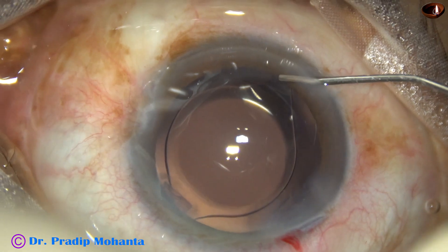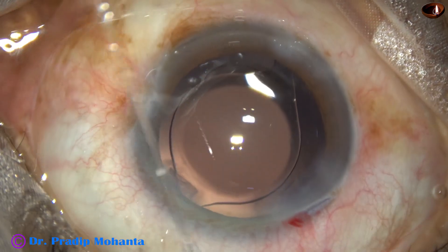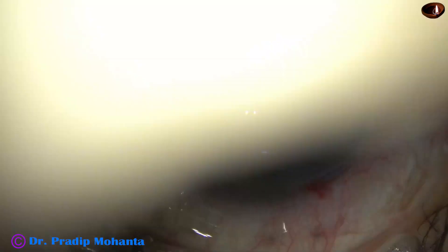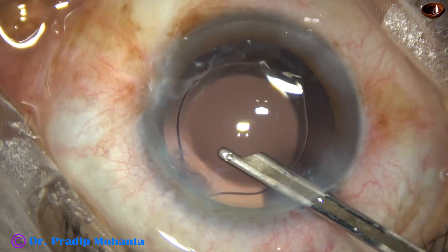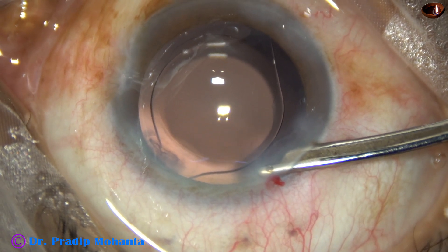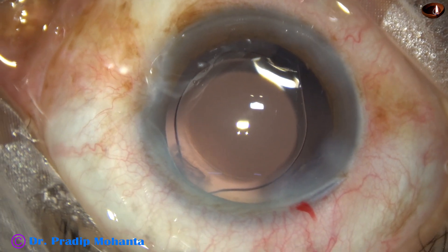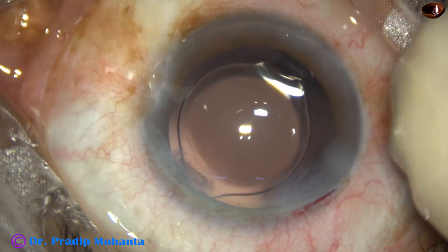This is a bit of moxifloxacin. And now the side ports are closed by hydrating the corneal stroma. Be careful — hydrate the scleral side of the side ports and gently inject only a small amount of fluid. Otherwise, there can be Descemet's membrane detachment. This is the final lavage of the anterior chamber. The anterior chamber is nicely formed, and now the integrity of all the wounds is checked. A few drops of moxifloxacin are applied over the ocular surface and the case is concluded.